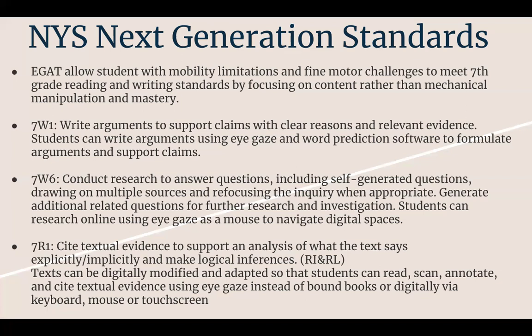7W6, so students can research online using the eye gaze as a mouse to navigate digital spaces. So now they can ask further questions and they can investigate independently. They don't need somebody to manipulate a mouse or move through texts. They can negotiate texts themselves.